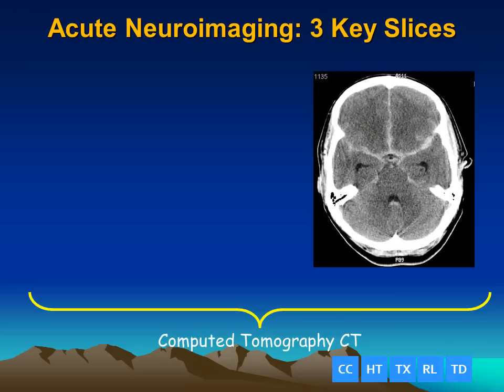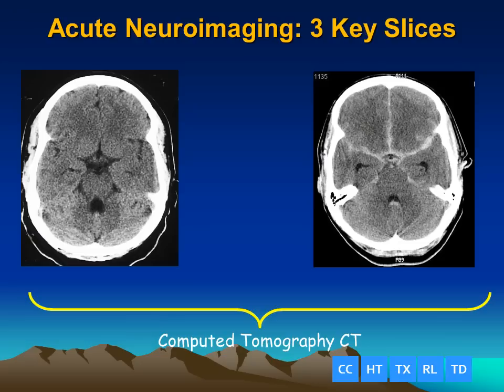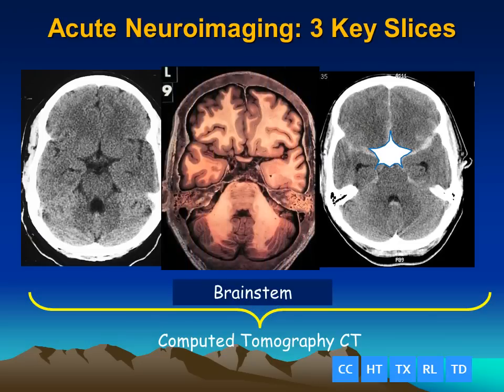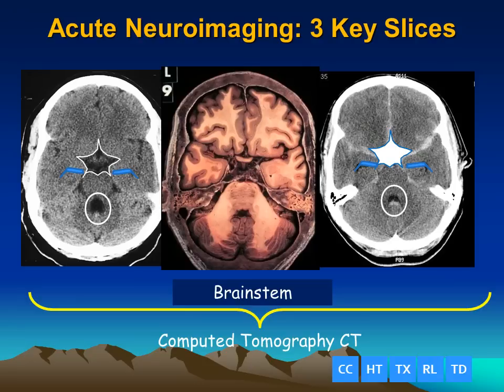Let's take a look at a case. Here is a patient that presented with the worst headache of their life. This is at the level of the suprasellar cistern and the brainstem. Comparison to the normal scan easily demonstrates that we have abnormal hyperattenuation from blood in the suprasellar cistern. This is the patient who has had a subarachnoid hemorrhage. We can also see a little bit of blood inside of the fourth ventricle.